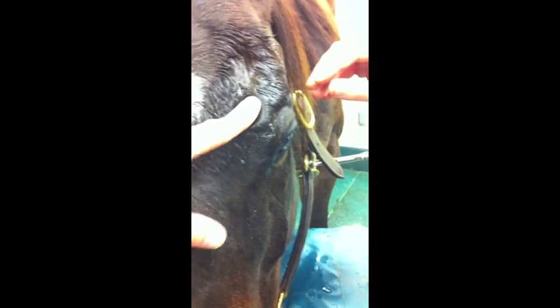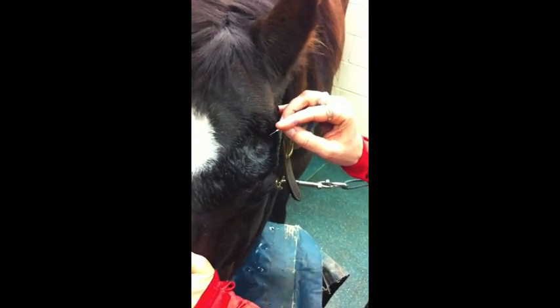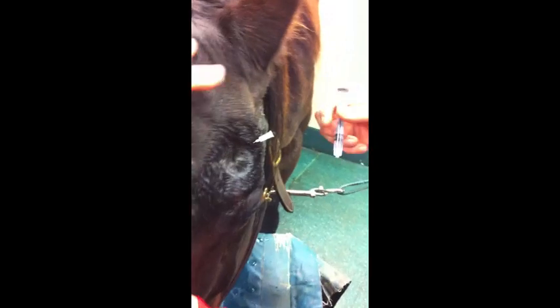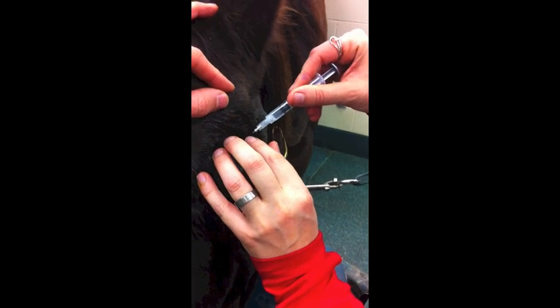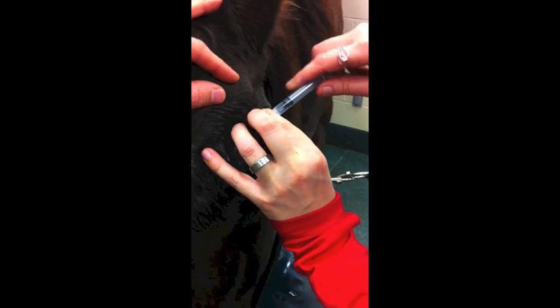Did you feel like you were subcutaneous or intradermal? Where were you? And you can palpate that you're close to it. You can always feel with your finger to make sure that the needle is very close. Aspirate, and then inject.